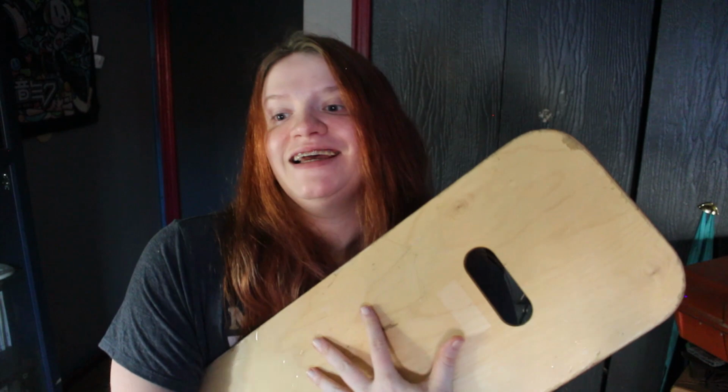So a slide board, basically, it's exactly what you say it is. You use it by putting it under your leg or your bottom, and then you basically grab onto something on the other side of where you want it to go, and then you scoot. And so basically, this guy is a little bit like my best friend. She is also referred to as a transfer board, and I think there's another name for it, but I can't really remember.